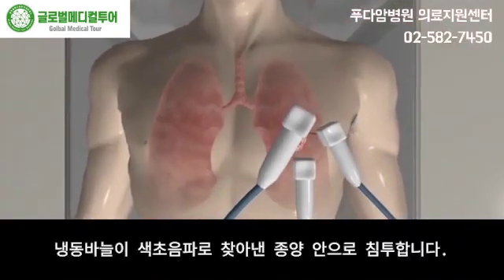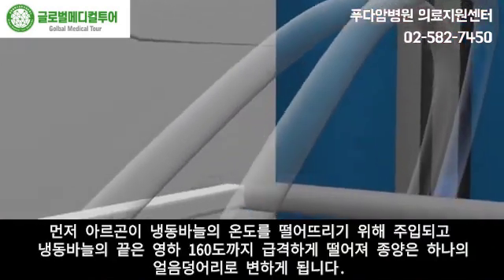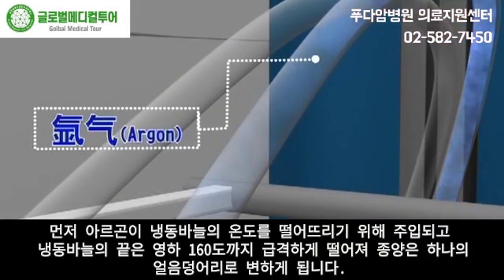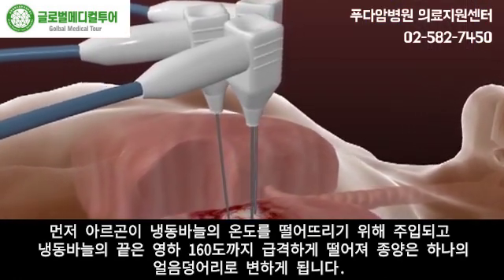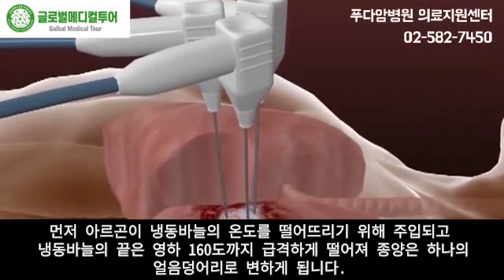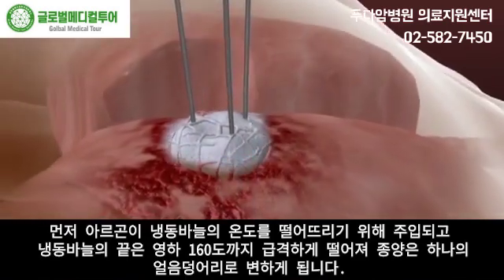Cryo needles are inserted into the tumor with the help of color ultrasound. Firstly, the argon is injected to lower the temperature of cryo needle tips precipitately to minus 160 degrees centigrade, which will in turn freeze the tumor, forming an ice ball.